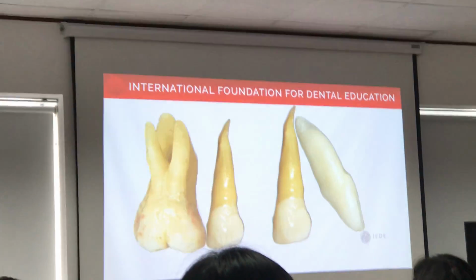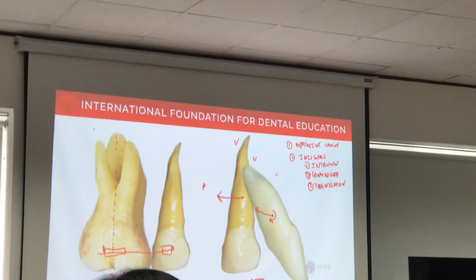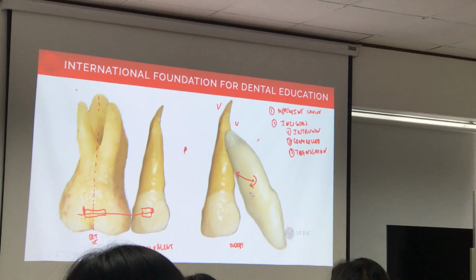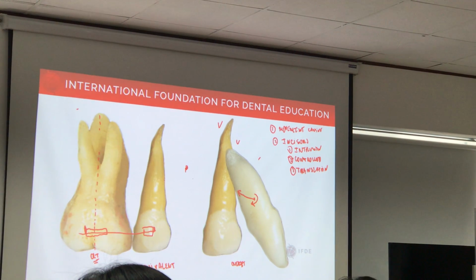So let's assume now you've been able to intrude the teeth. To intrude, the first movement you want to do on a case like this is forget about that. Just do this first. And to do this, you go back. We'll revisit this later. It's a simple system.